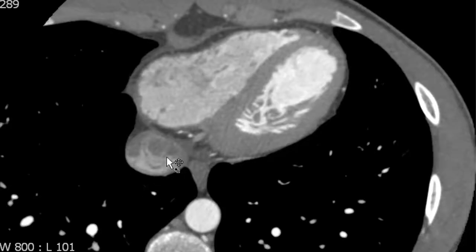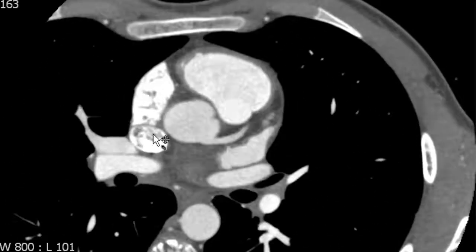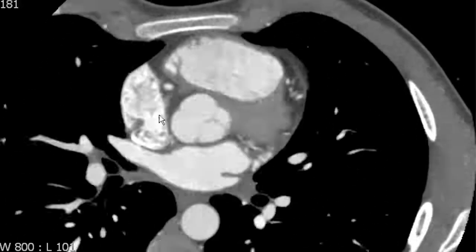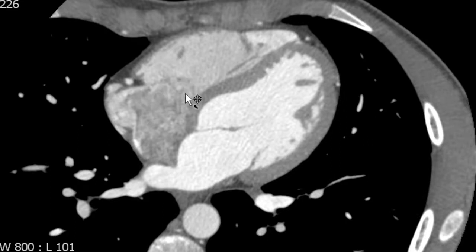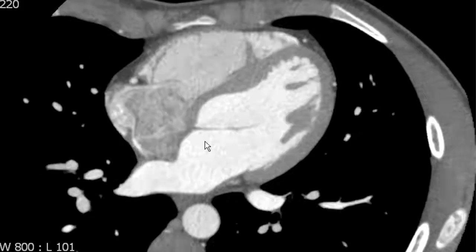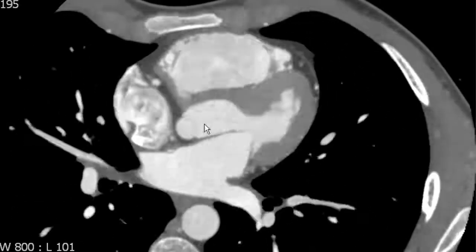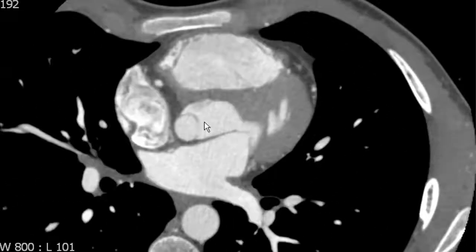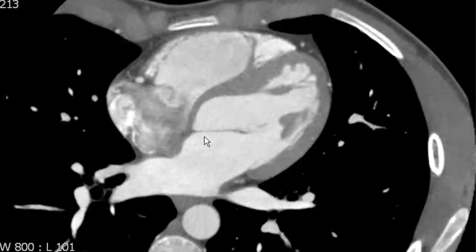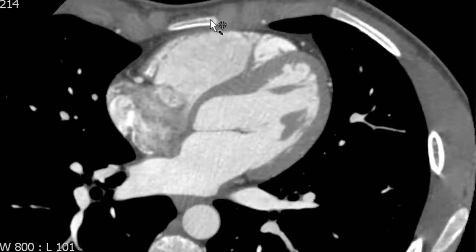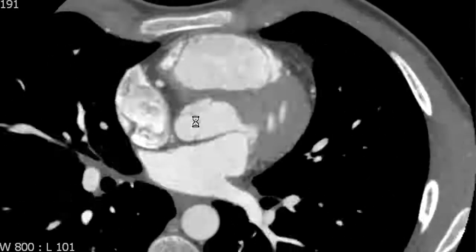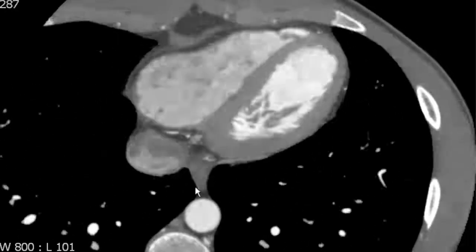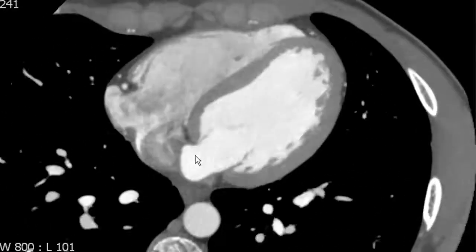We can see that the IVC and SVC empty into the right atrium, and it is separated from the next chamber by the tricuspid valve. The next chamber is the right ventricle. Another landmark that you can use external to the heart to identify the right ventricle is the sternum — the chamber that is closest to the sternum is the right ventricle. We'll talk more about the right ventricle in detail later.